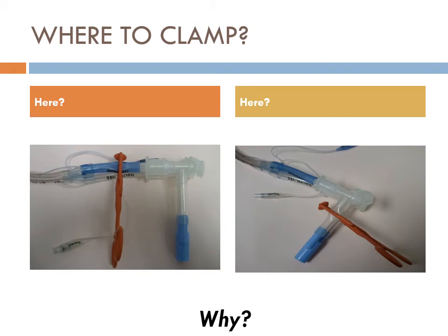Okay, so right now, if I just want to ventilate this patient before surgery starts, I don't need to do anything with the bronchial cuff. There's no reason to put pressure on the actual membrane of the tissue in the bronchus unless you absolutely need to drop that lung. So I do absolutely nothing with that blue cuff. And before I put this tube in, I make sure all the air is out of the cuff too. So right now, I'm just going to ventilate through both sides because this whole lumen is split into two chambers. So why put all that pressure into just the tracheal side? I could actually clamp this. If I clamp the bronchial, and I just ventilate it.